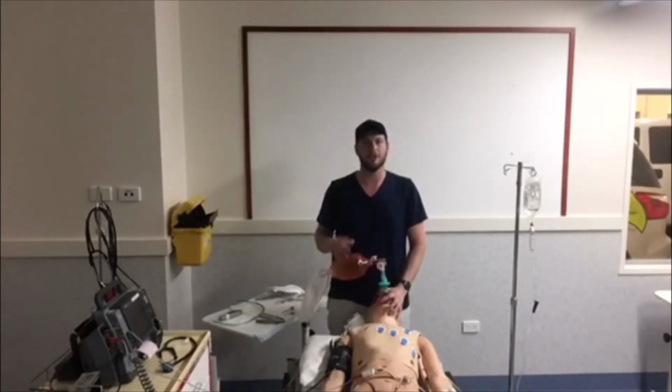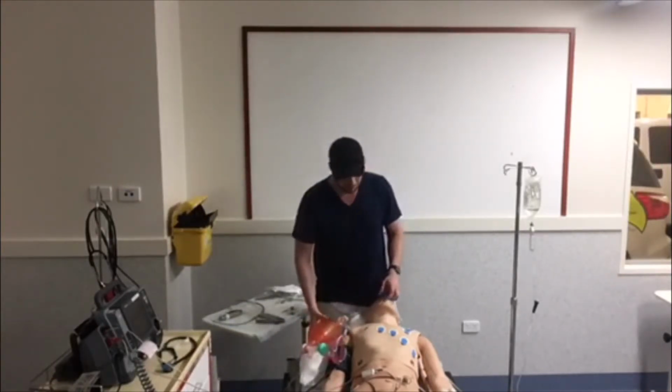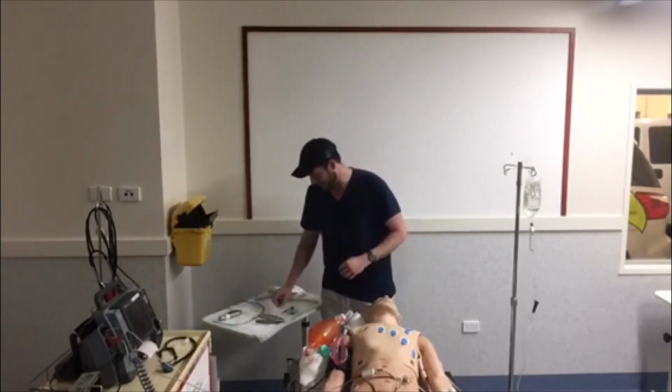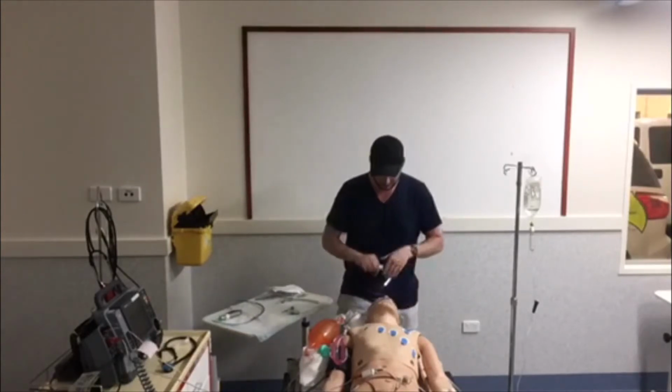Once that patient's respiratory drive starts to drop off, we can still ventilate them a bit more, and then we can perform the procedure of laryngoscopy with an ET. So I'll do that now. Of course I've got my appropriate PPE on as well, with my gloves and glasses.